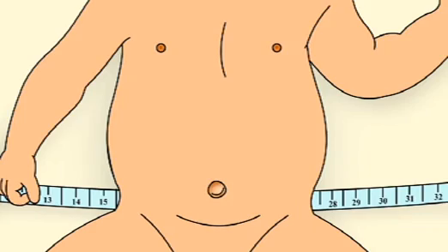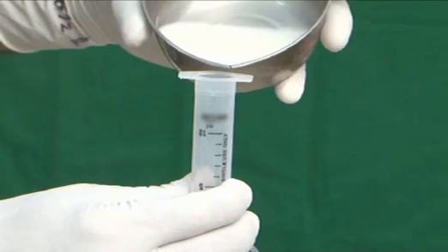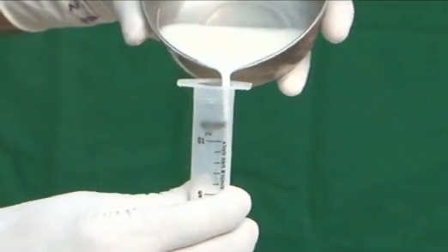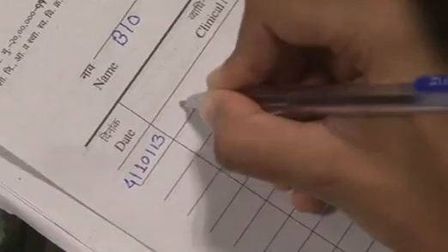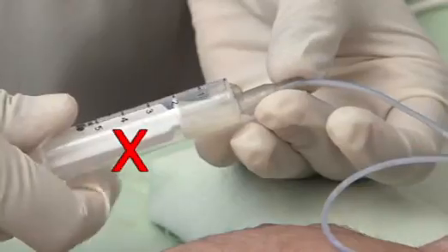To assess tolerance of feeding, measure abdominal girth prior to each feed. This should be repeated before each feed and the reading should be recorded in the case file. Routine pre-feed aspirate should not be performed.